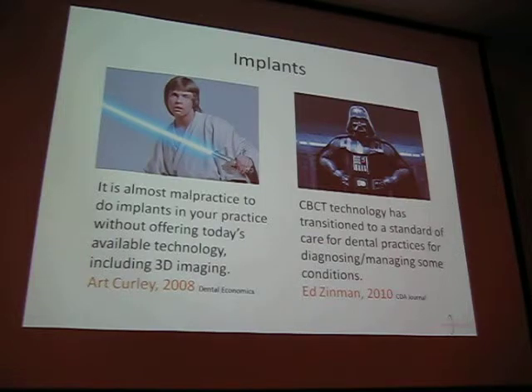So, you know, if CTs were just in Alaska, not really the standard. But these two both agree that when you have a CT for implants, you're pretty well covered. When you don't, you're pretty well not. And I actually have an entire legal sheet, a table in the back, talking about all the lawyers and what they say. But it's not a bad idea just to evaluate what's going on. End of our scary part.